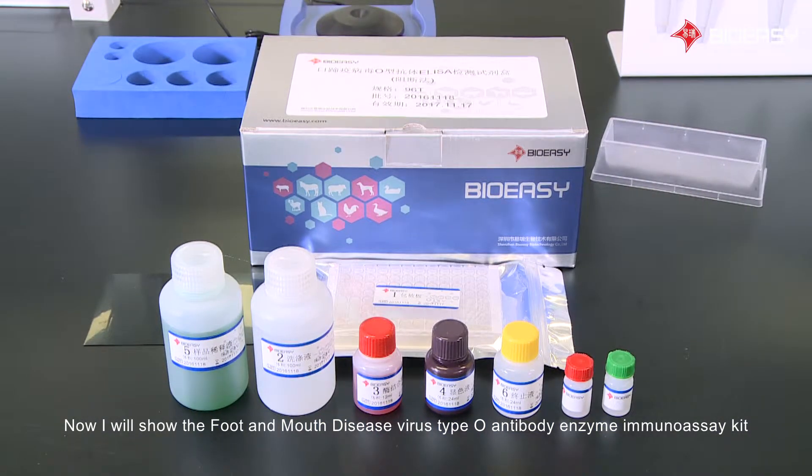Now I will show you the Foot and Mouth Disease virus type O antibody enzyme immunoassay kit.